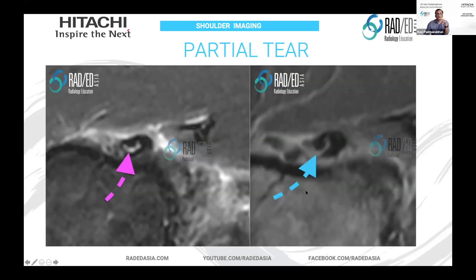Tears also show a high signal, but you need to look at the degree of signal. If you look at this image, this is a very bright signal comparable to fluid. This is a small amount of fluid here — this is more of a fluid signal, not an intermediate signal. So when you see this fluid signal, this is what tells you that there's a tear. The tendon itself otherwise looks relatively okay; we've got a nice black tendon elsewhere, relatively well defined. So we just have a partial tear within the tendon — an intrasubstance tear of the biceps tendon.